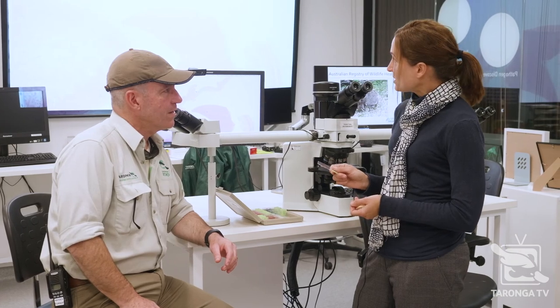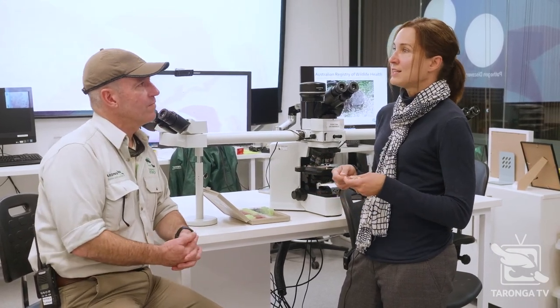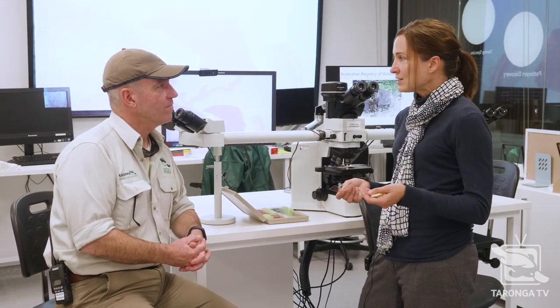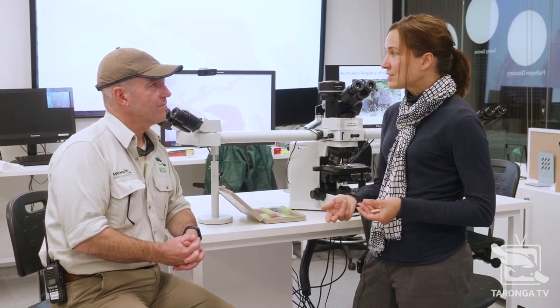So we would look at these tissues under the microscope to try to find out if there's inflammation, if there's evidence of toxic change, if there's evidence of any tumor formation, try to find the general process that's going on. And then once we've narrowed it down, we can take some of the tissues that we have in the freezers, which we've got tissues going back to 1998 that live at minus 80 degrees in some of our freezer banks. And we can pull those out, and we can either do viral culture, bacterial culture, toxicology.